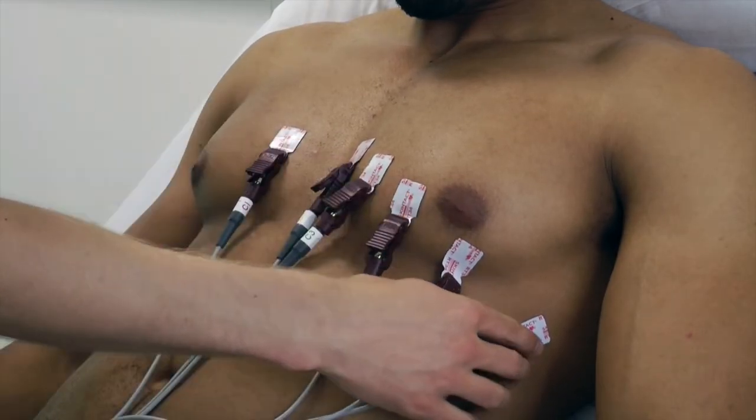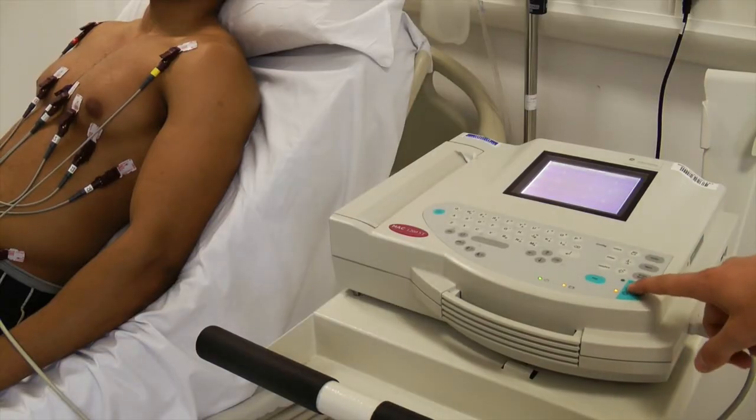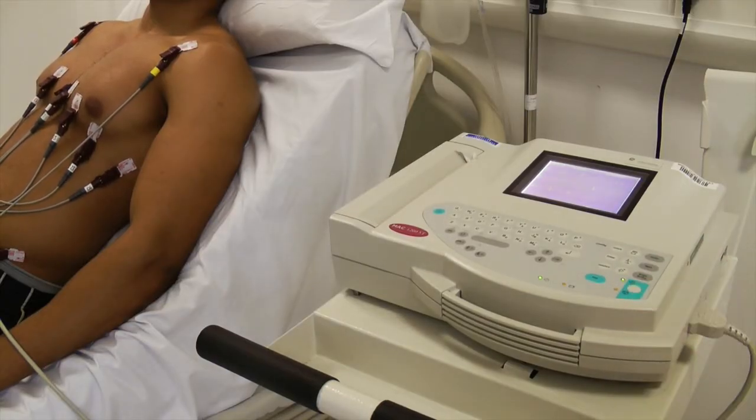Ask the patient to remain still while you press the button to start the ECG. Instruct them to breathe normally, but ask them not to talk.